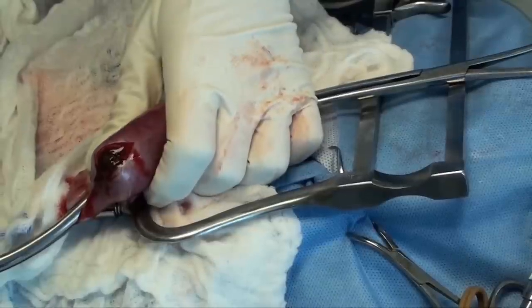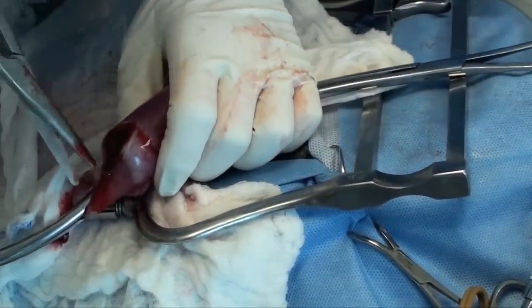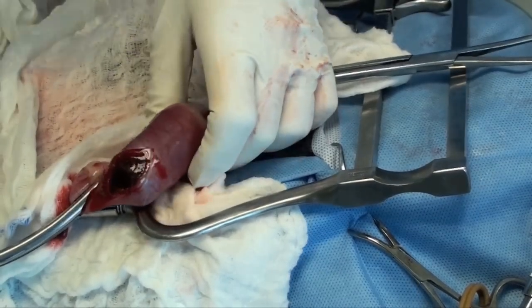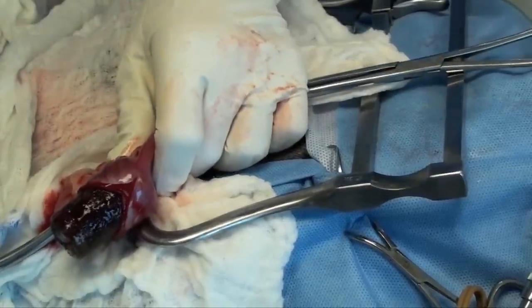So we're just going to take it out by making an incision either over the foreign body, because the tissues are quite healthy. Or in this particular case, I'm going to go a little more ab-orad to that foreign body — so further down the bowel from the foreign body — and I'm just going to push the foreign body out.